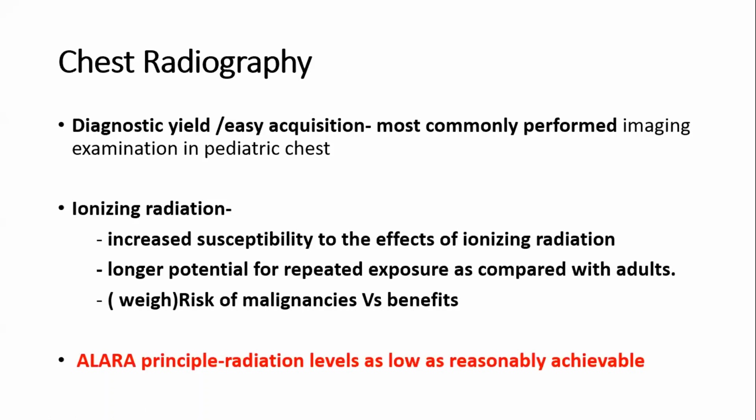Chest radiography. We have several imaging modalities to image the chest. The commonest one is chest radiography. It has been there since probably 1896, providing a unique and immense service to mankind. Because of its diagnostic yield and easy acquisition, it's the most commonly performed imaging modality in the chest.